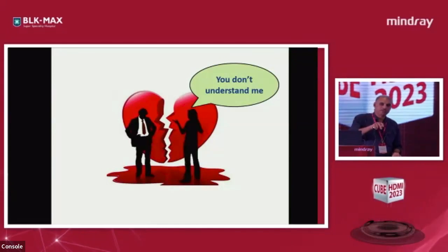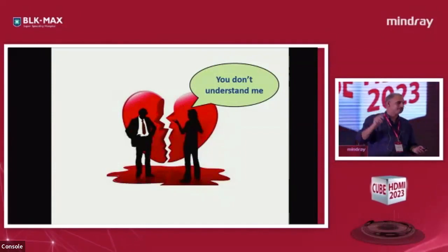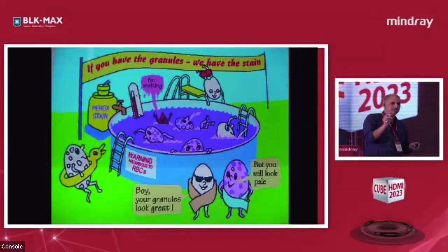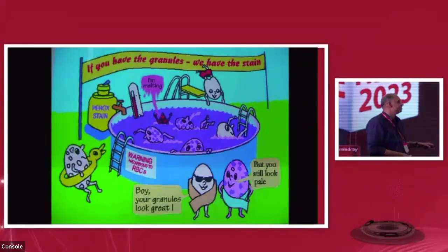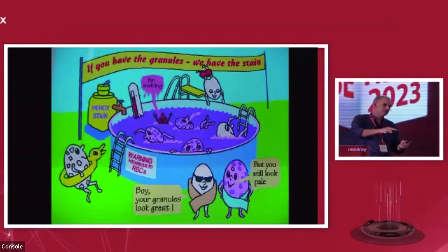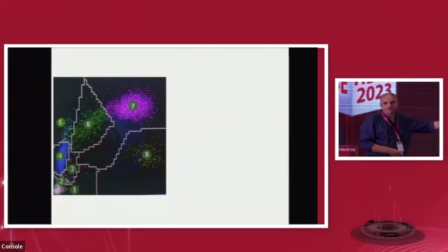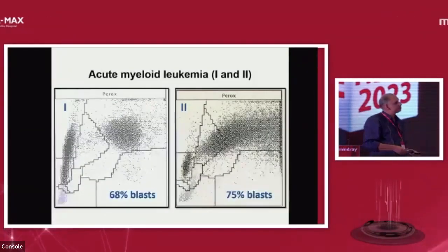I was working on ADVIA, which uses the myeloperoxidase principle for staining before the laser scatters the cells. So in that, all the cells are put in a mixture with myeloperoxidase. Those that stain, can I take the liberty of 3-4 minutes? Okay. So the cells that stain positive go as neutrophils. Those that do not, lymphos. If there are blasts, large unstained population, which is MPO negative. So that's where, on number 7, the pink cloud is where the neutrophils come in. That's a label. The neutrophils, metamyelocytes, bands all go there.